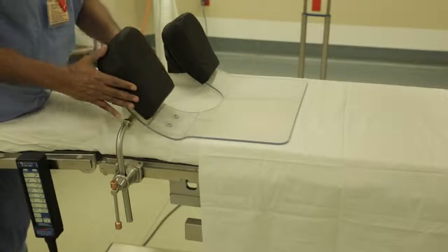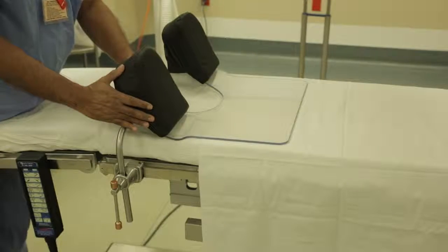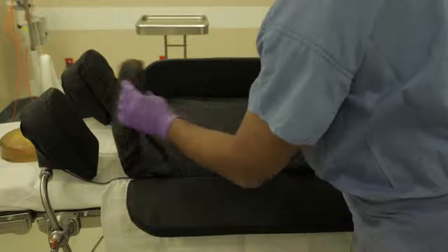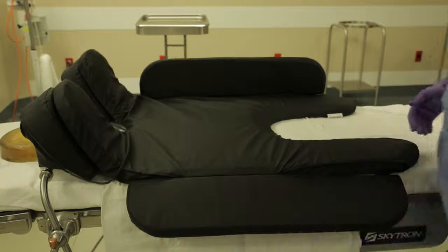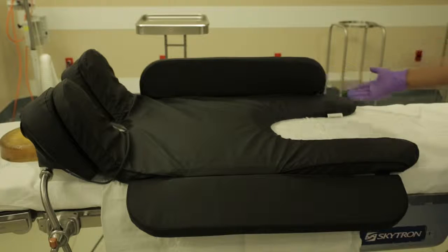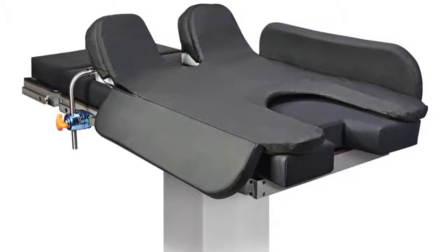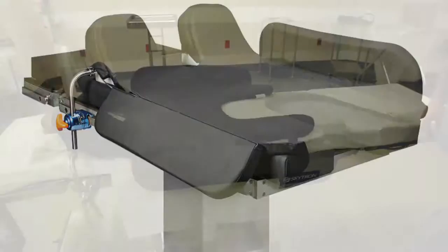Place the TPS stabilizer wedge pads onto the stabilizer wedges. Place the TPS gel pad onto the TPS foundation with the top of the pad aligned with the tops of the TPS stabilizer pads. Position the smaller cutout at the head of the table and the larger cutout at the bottom.